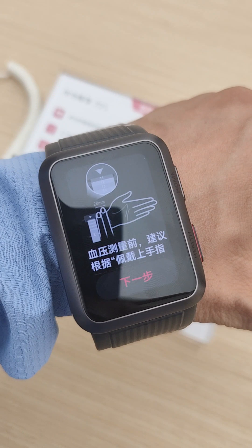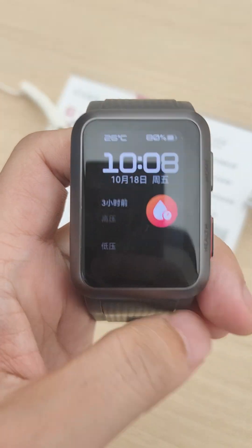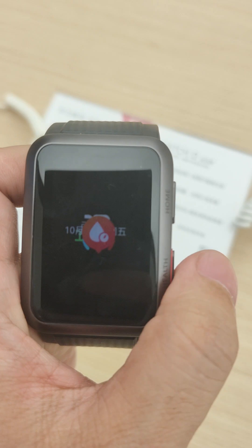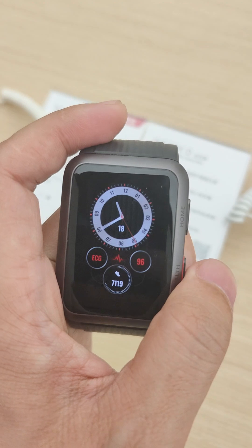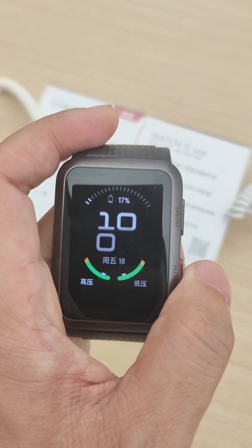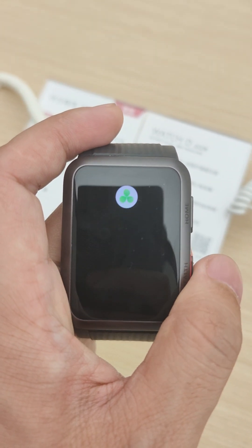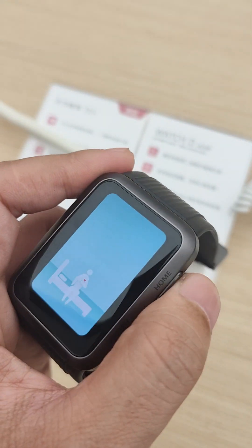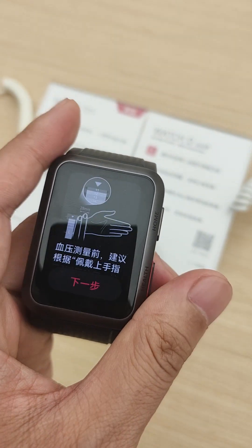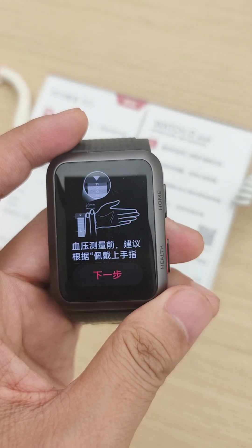We can follow the instructions step by step and get a healthy status reading. This is the health button — you can press it. We can also take steps to measure blood pressure and detect your heart rate. This button here is for blood pressure.